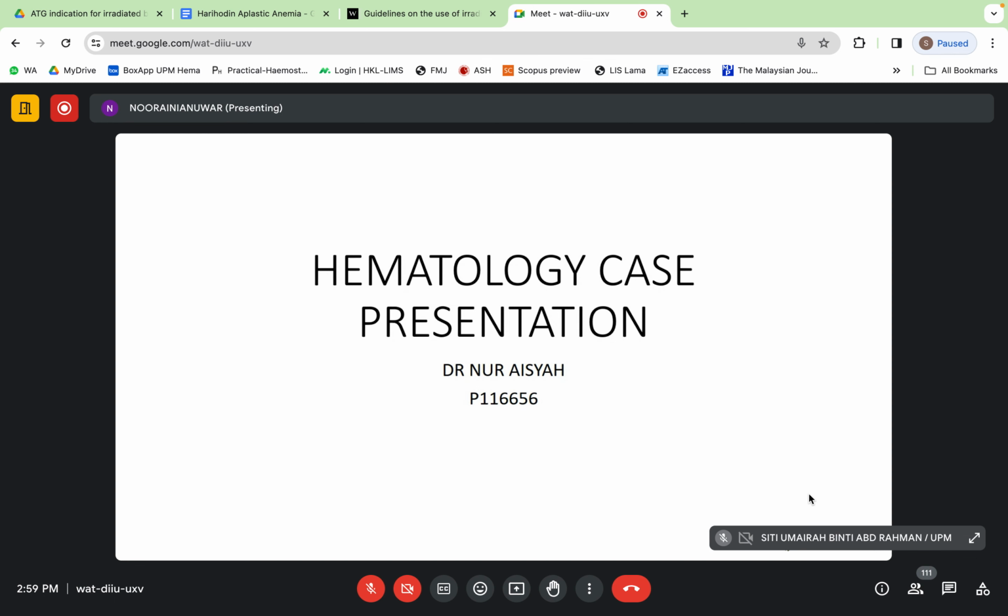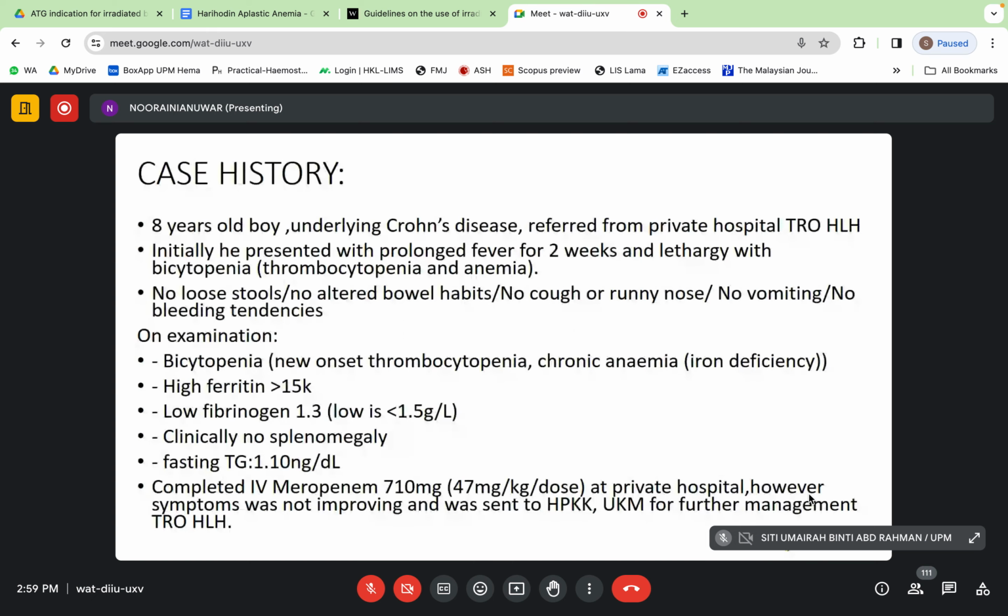Today I will be presenting another morphology case for pediatrics. My name is, by the way, Nur Aisha. This case was referred from another private center to our center. This is a case of an 8 year old boy with underlying Crohn disease, referred from a private hospital to rule out HLH.